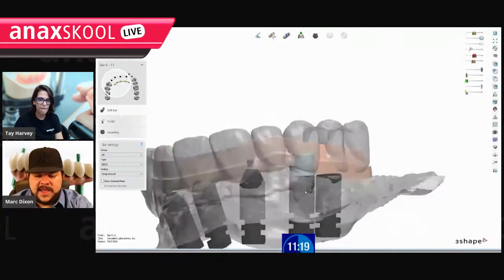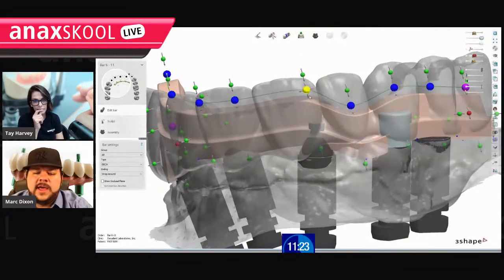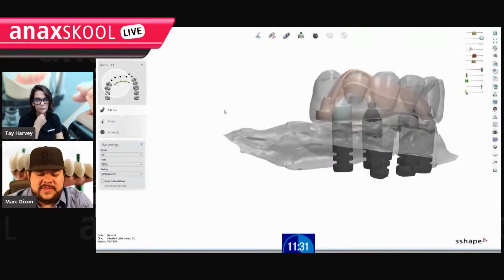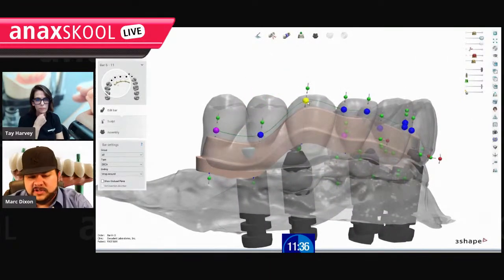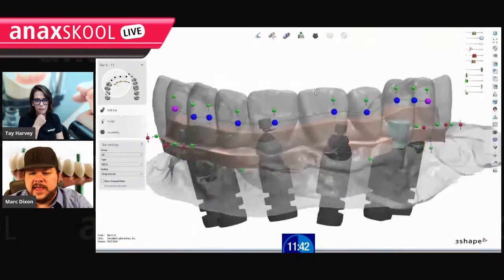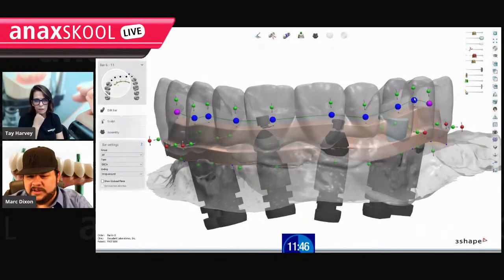When I brought it into the denture module, everything looked good. I was like, all right. And then my entire preparation arch, which was actually a scan of the bar, went low poly. And I was like, well, yeah, that makes sense because it's building like a denture. It doesn't need a super high def edentulous arch. So it saves on bandwidth or whatever. And all of a sudden my arch just went low poly, distorted, not as detailed.